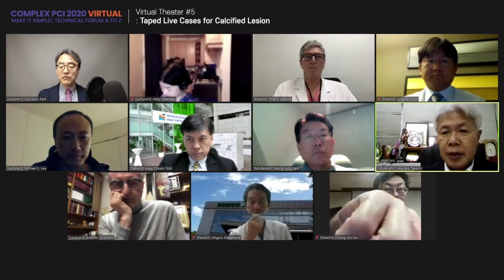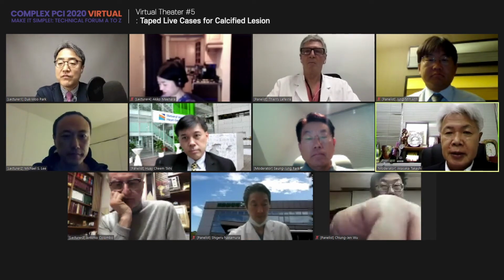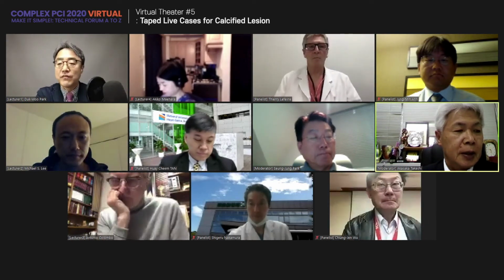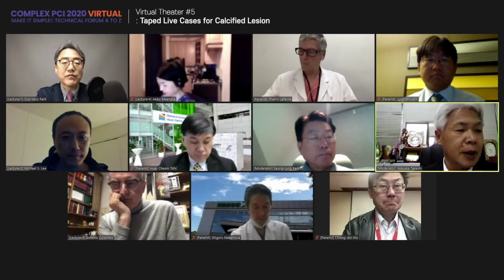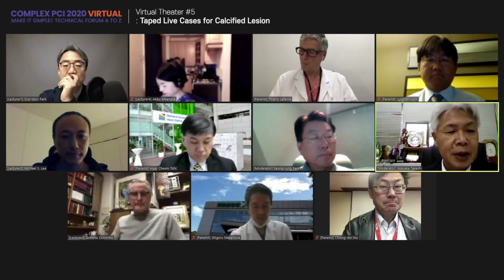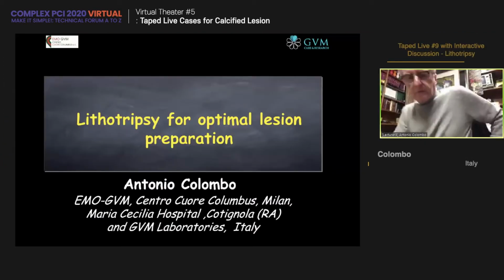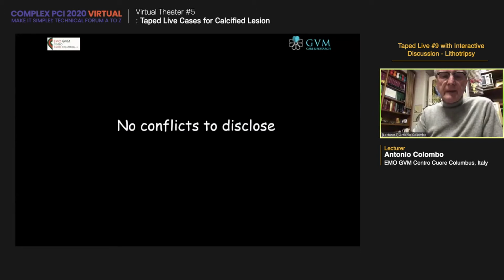Okay, thank you very much. A very tough case and wonderful results, and we will discuss later after the last presentation. The third presentation is a live case number 9 with an interactive discussion, lithotripsy treatment. This will be presented by Dr. Antonio Colombo. So I think lithotripsy is an excellent, safe and practical way to get optimal lesion preparation.